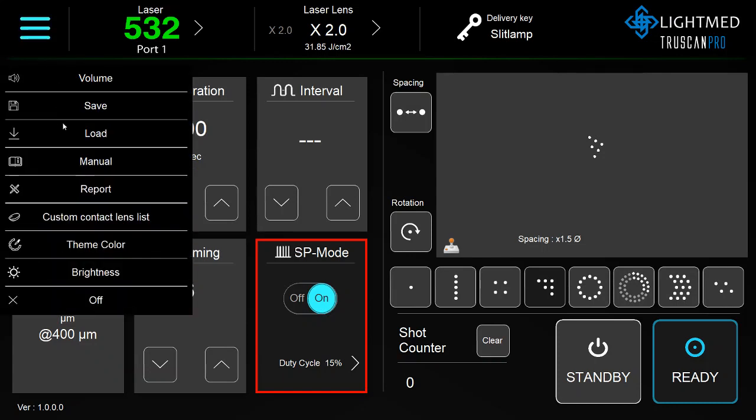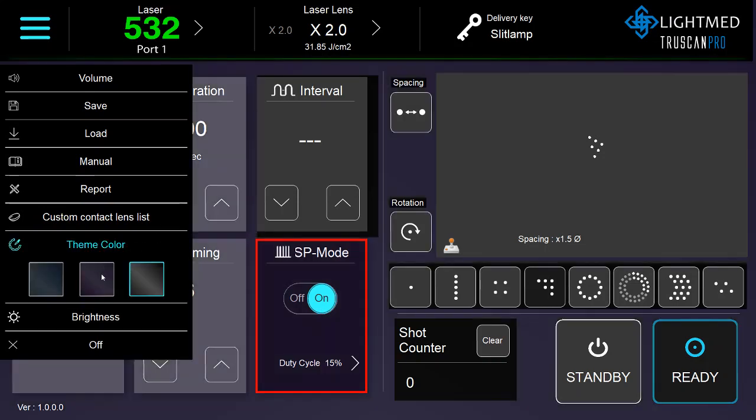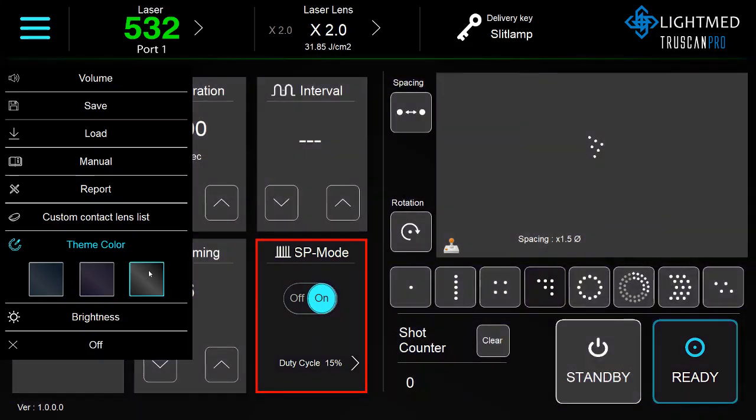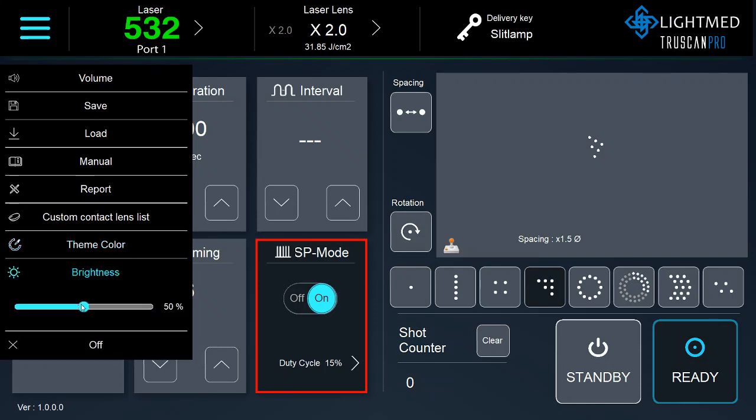You can change the contact lenses here, and you can adjust the theme color. You can also adjust the brightness of the graphic user interface.